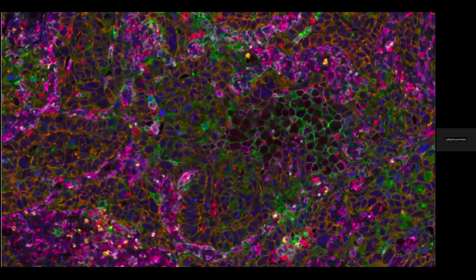What else is there I can point out? And then in here, these are leukocytes, which is a mix of the red and the pink, which is your macrophages. But if we look over here, which I'm going to focus on for now, we are actually missing some staining. I'm going to zoom in on that.